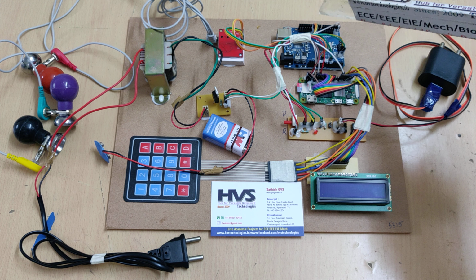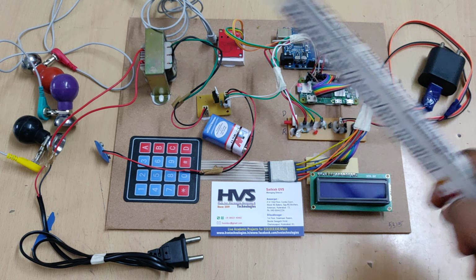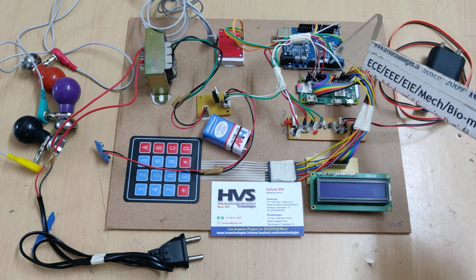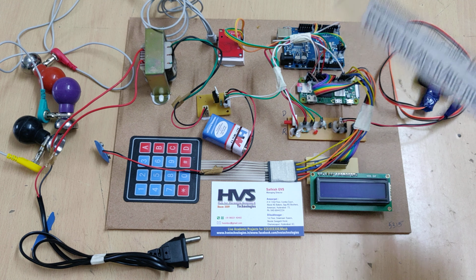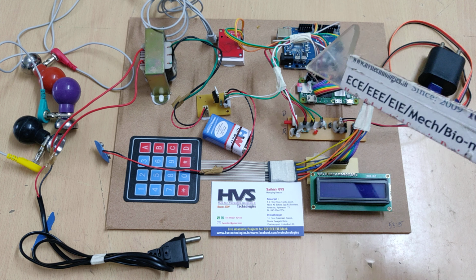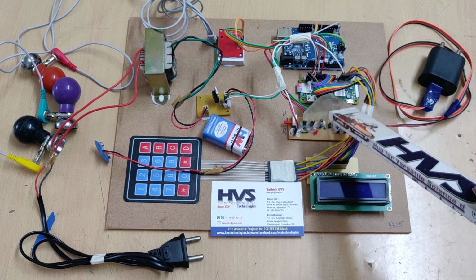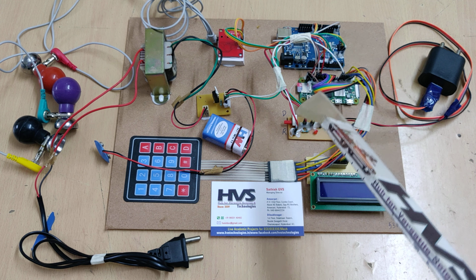Two are digital inputs. Those two pins inform the UNO board about the proper connection of these three electrodes. Another is A0, which is the analog input. From the AD8232 pin to the UNO board, from there we convert the analog data to serial and input it to our Raspberry Pi. There we are going to calculate and also find the diseases.